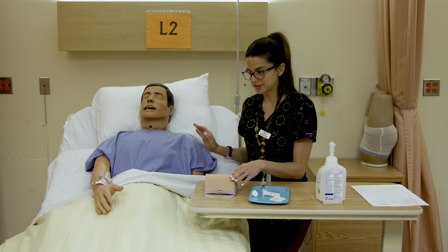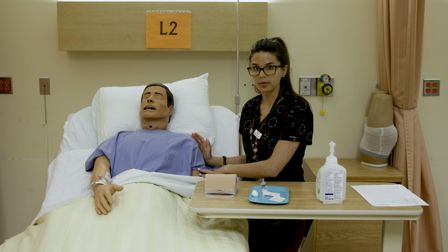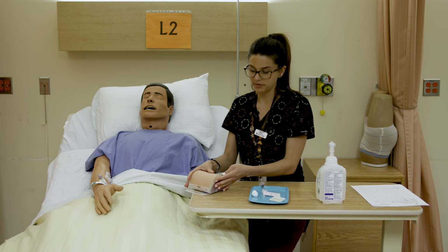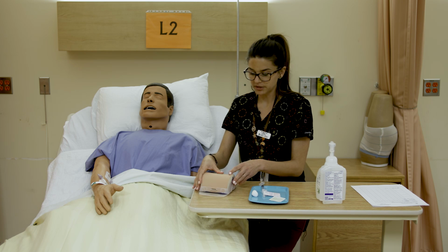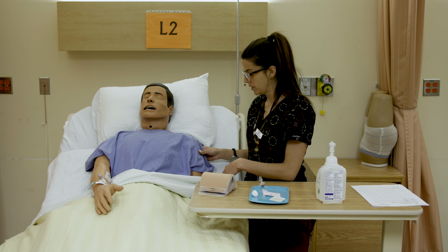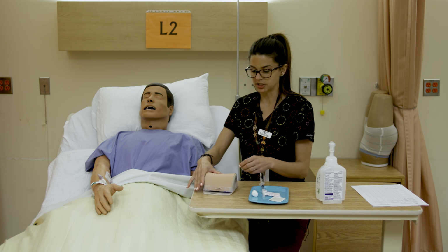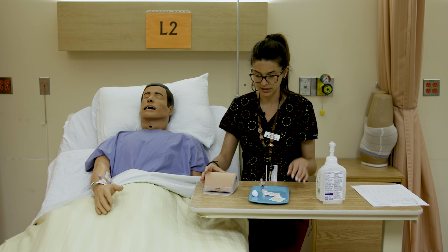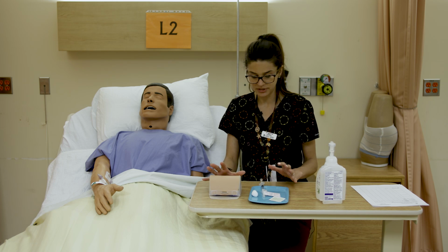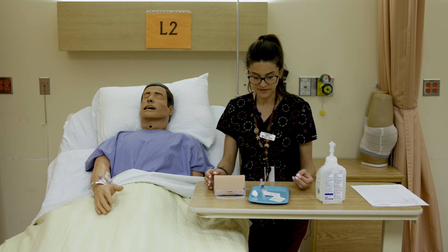So you'll find sometimes, especially with the deltoid site, it's very hard to do that lateral pull for Z-tracking. You can work around that by pulling down on the tissue. Whichever way you're displacing it, you're just pulling it tight. If it works better, maybe someone has a smaller arm, you can pull down to do your Z-tracking, and then just hold it tight, do your injection, and let go only once the needle is out.